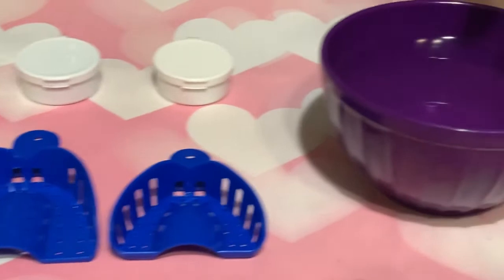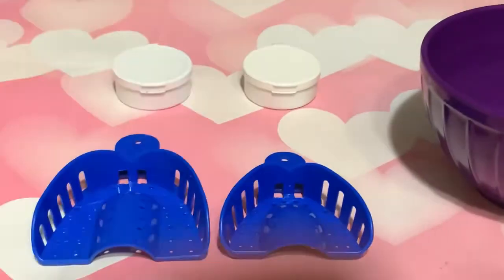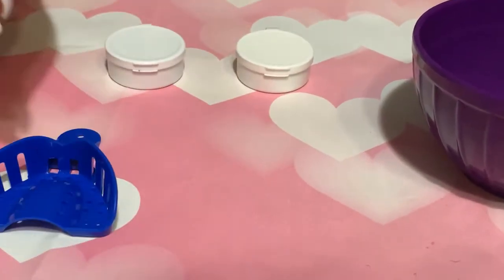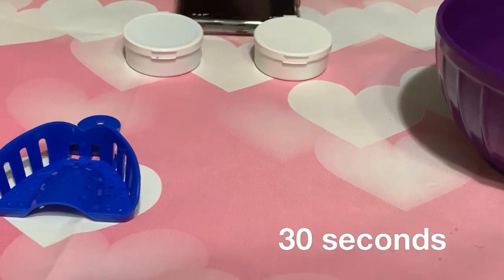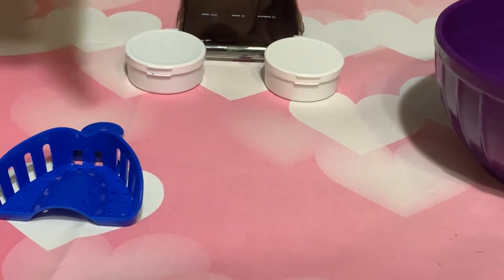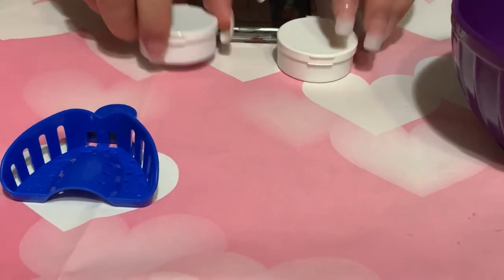Okay, now we have our bowl of cold water ready and waiting. Now my son is going to mix the 2 putties together, and, well, this is not my mouth. That's too big for my mouth. And we're going to put it in here. Now we have set the timer for 30 seconds. So then he will have time to roll it and then put it in there, and then I can pop it in my mouth. Okay, you ready? Okay.